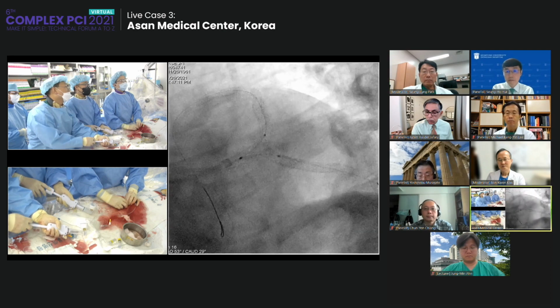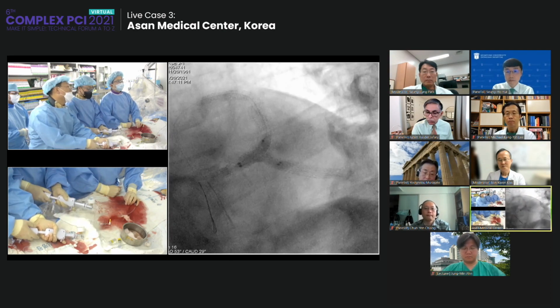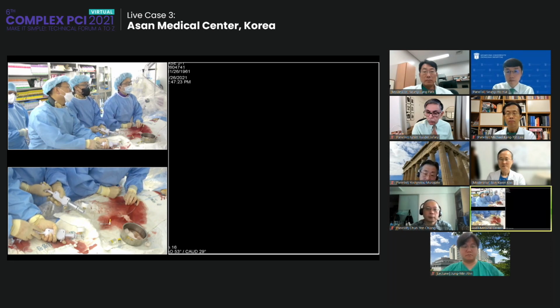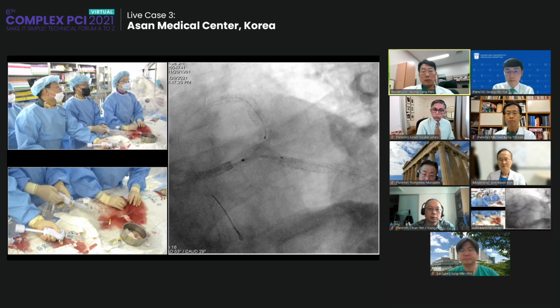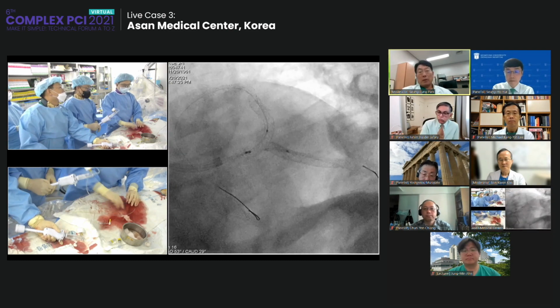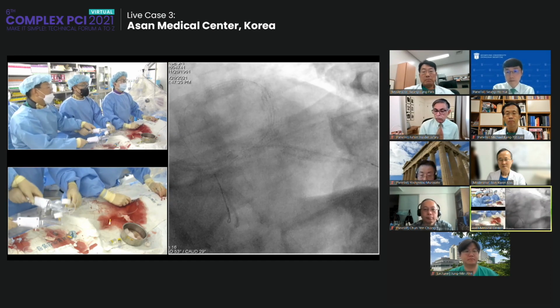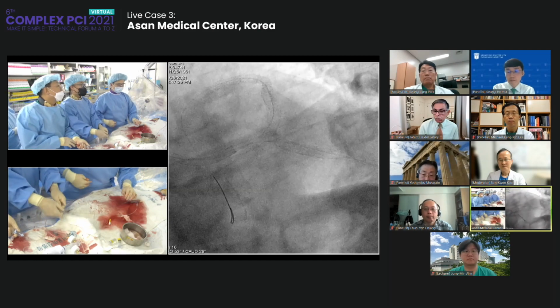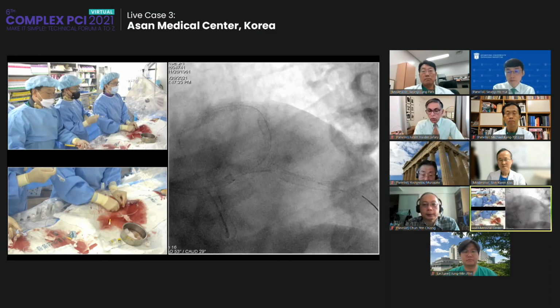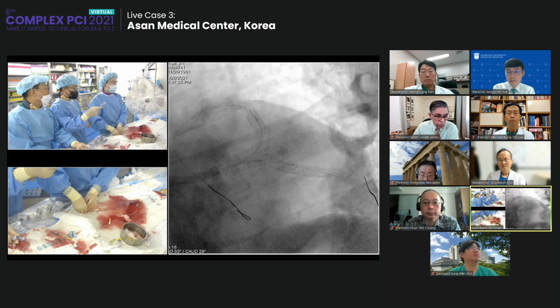Then? High pressure? 12. Okay. 1, 2, 3. 12. Okay, good. I think we're going to check the final angio. Yeah, angio. Angio, please. Yep. Okay. Just that. Okay. In the balloon. Check the angio. So, and the procedure itself.